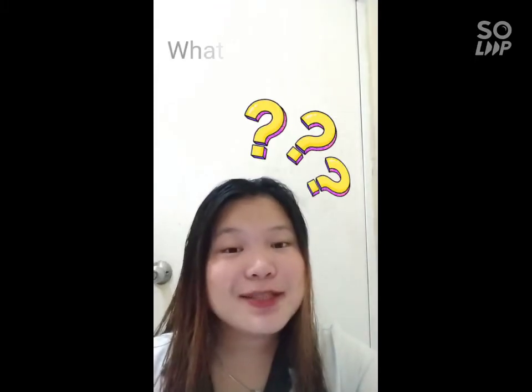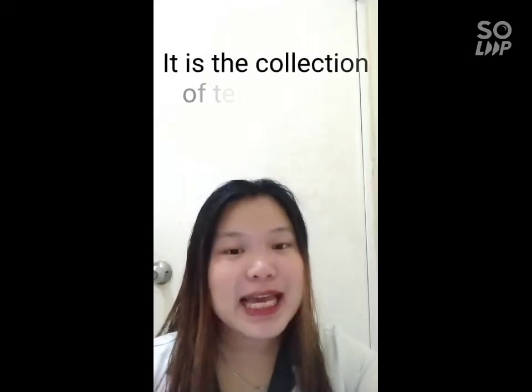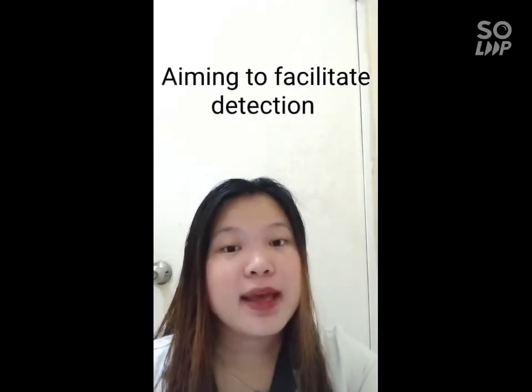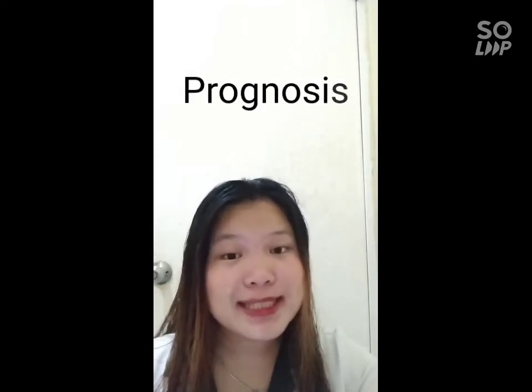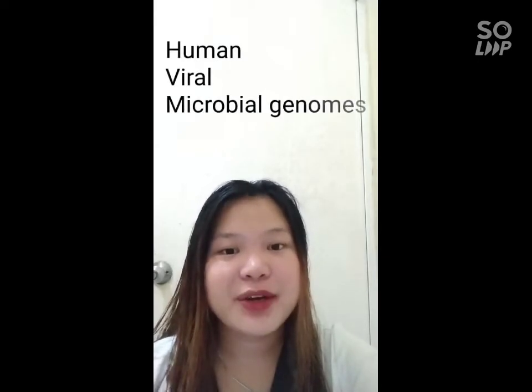So, what is molecular diagnostics? Molecular diagnostics is the collection of techniques that is used for the detection of genomic variants, aiming to facilitate detection, diagnosis, subclassification, prognosis, and monitoring response to therapy. It is the rapidly developing area of laboratory medicine that investigates human, viral, and microbial genomes and the products they encode.